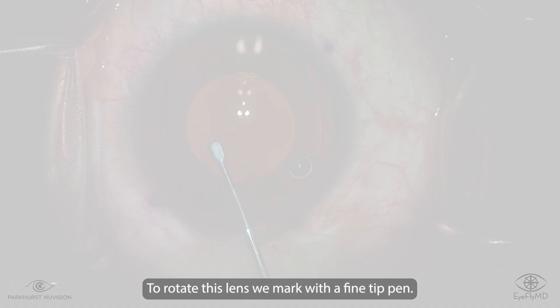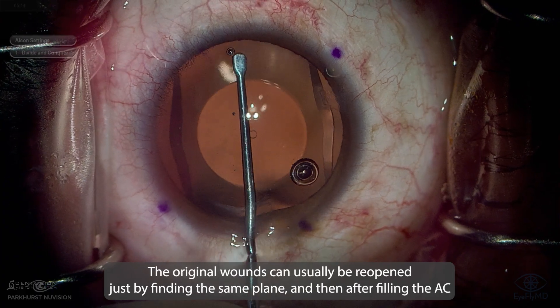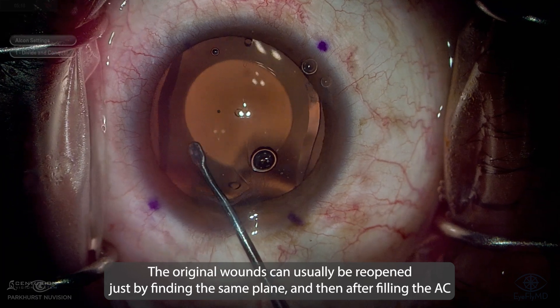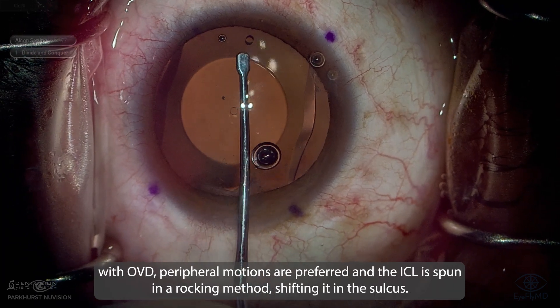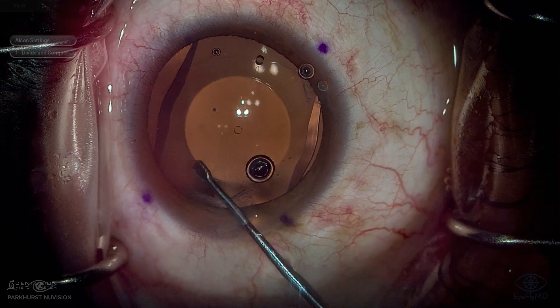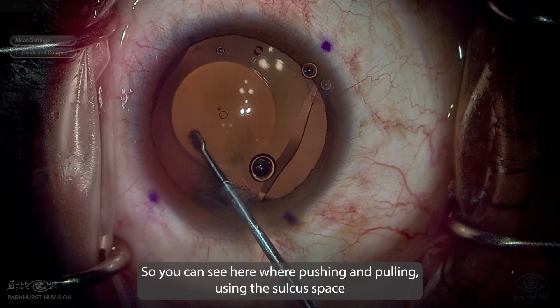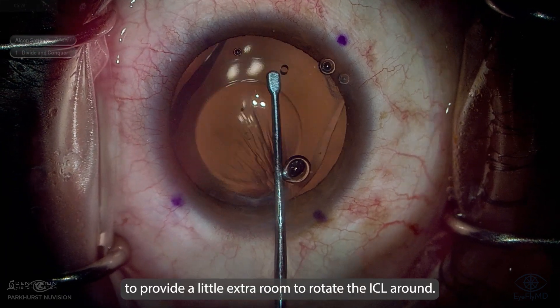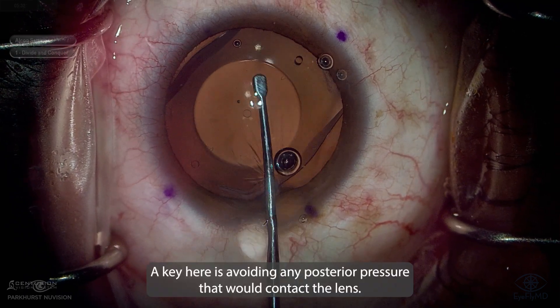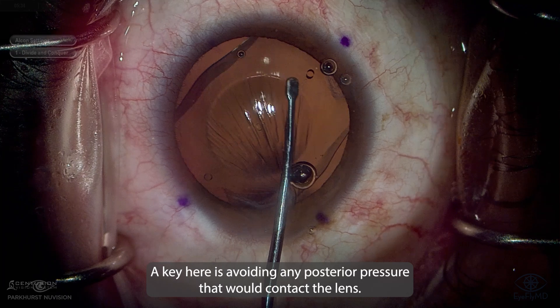So to rotate this lens, we mark with a fine tip pen. The original wounds can usually be reopened just by finding the same plane, and then after filling the AC with OVD, peripheral motions are preferred and the ICL is spun in a rocking method, shifting it in the sulcus. You can see here we're pushing and pulling, using the sulcus space to provide a little extra room to rotate the ICL around.